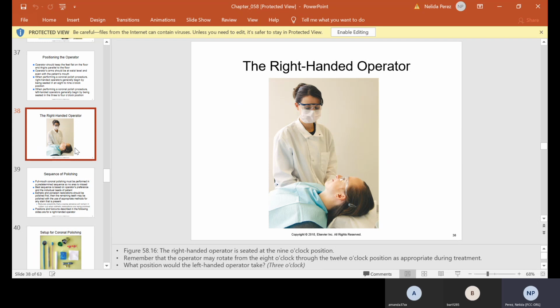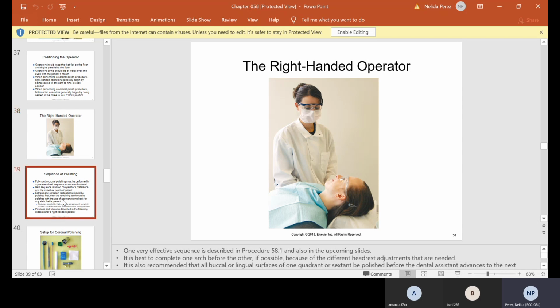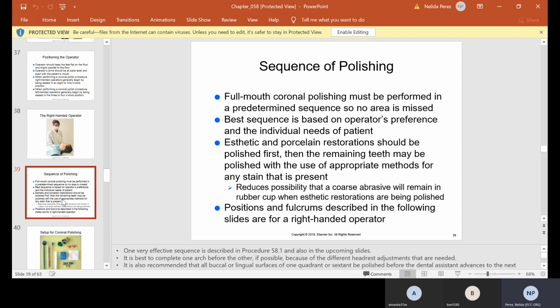Okay. Now, there's a picture of the assistant. The assistant is usually the one that does the polishing. Again, if it's a little bit more complicated than polishing, then the hygienist will do the cleaning. Now, full mouth coronal polishing must be performed in a predetermined sequence, so no areas missed. Best sequence is based on operator's preference and the individual needs of patient.